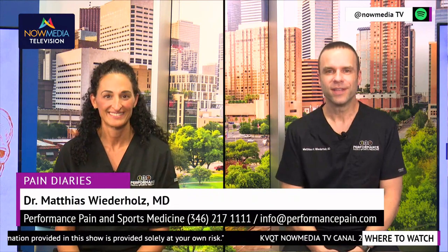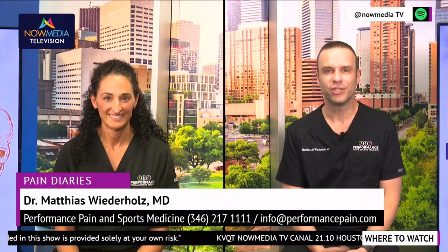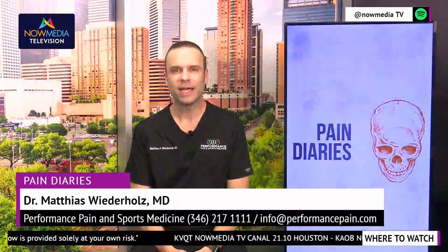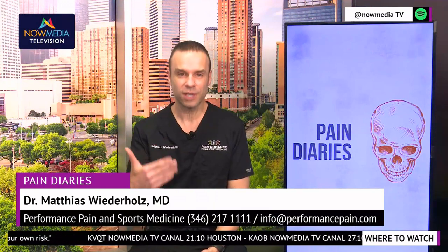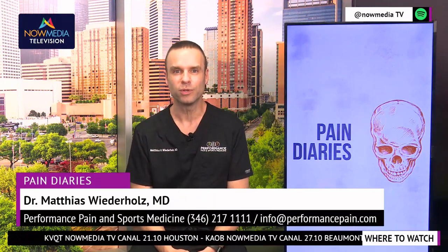Great question. So spinal cord stimulation is an implant of a device that delivers impulses to the spinal cord to block pain signals. And it basically confuses the brain so that you don't feel the pain.